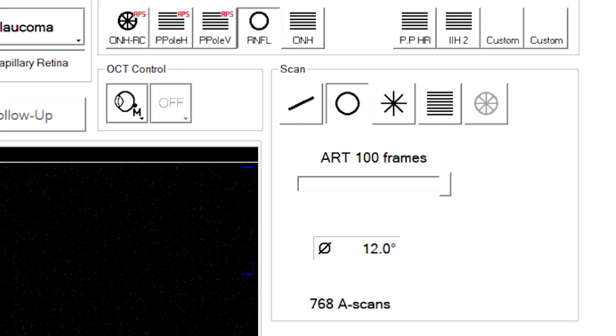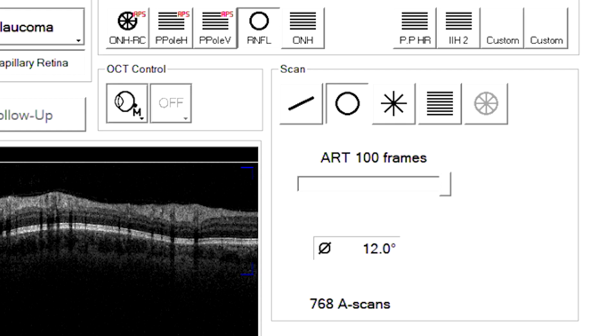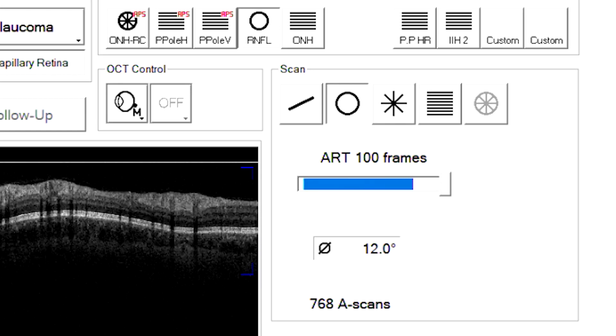When capturing the RNFL, the image should be allowed to reach an ART of 100 frames for maximum clarity.